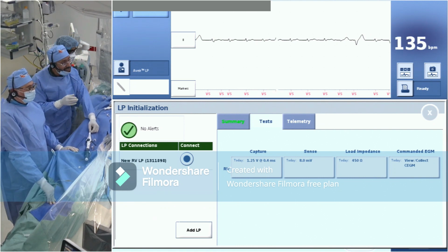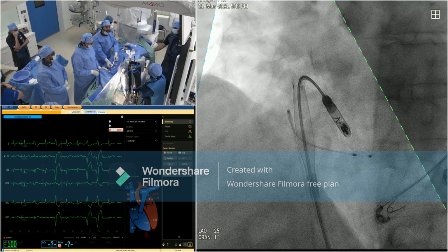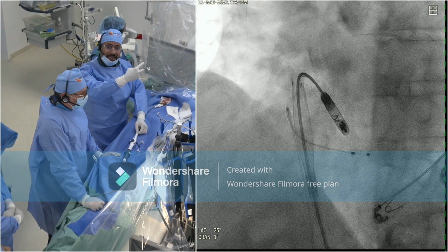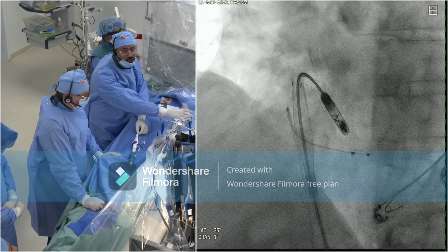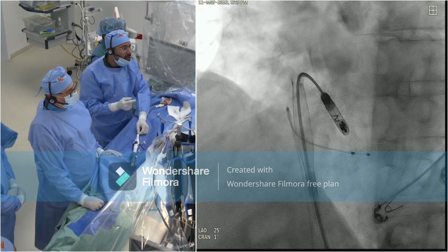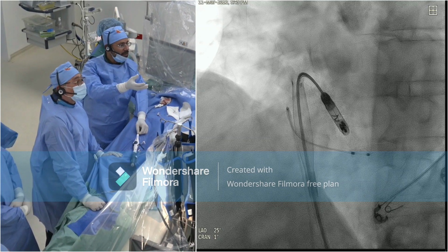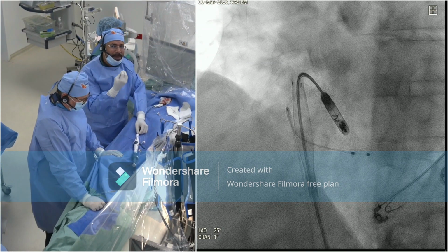At this stage, we have to take a cine, like the one we took, and we need to show it because we will fix the device now by rotation, and we have to see this marker on the fluoro. I hope you can appreciate the marker, which is like a V shape, or 7 in Arabic language, as you can see. When we rotate and come back to the same level, this will be considered as one rotation. And once we reach that level, we will make another half turn. So this is 1.5. But this is a bit tricky still. We have to do it bit by bit, because this movement from our hand, or Dr. Raed's hands, who will do the pleasure, is transmitted all the way. So you will not rotate very quickly, because you need to see the pattern, how it will rotate.